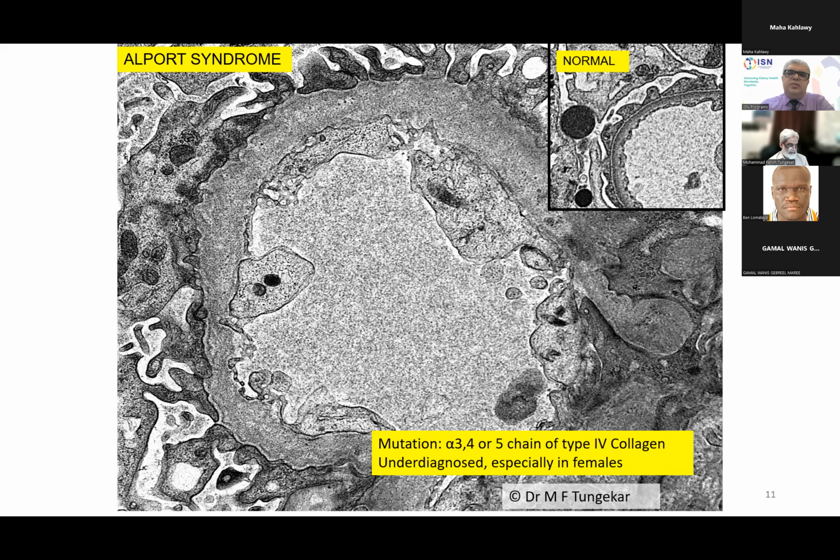I would like Dr. Muhammad to comment on these two cases, and I have two questions for him. For membranous nephropathy, when we stain for C4d, the positive control to test C4d is membranous. We should run the test for membranous. And I would like to ask Dr. Muhammad about his experience or comment on the anti-phospholipase A2 receptor. I would like to know if he regularly stains membranous cases for the anti-phospholipase A2 receptor, and I would like to hear from him.